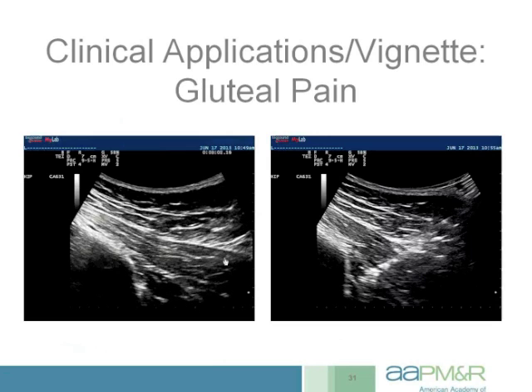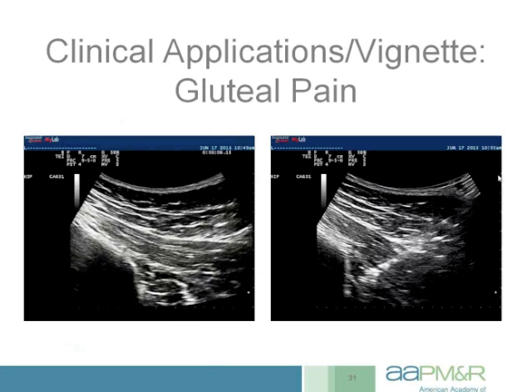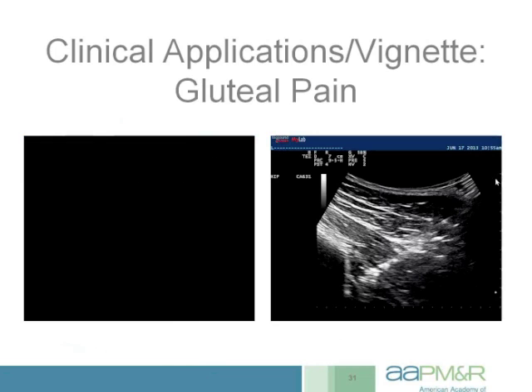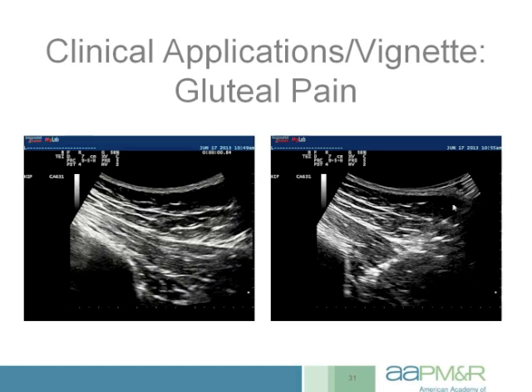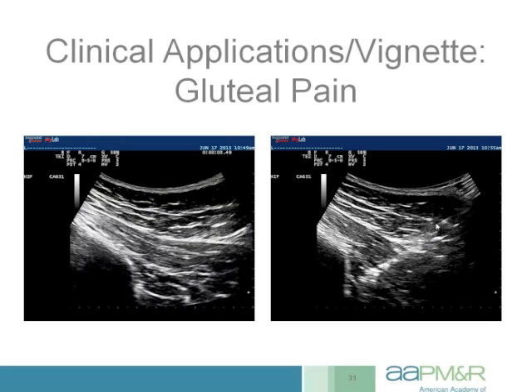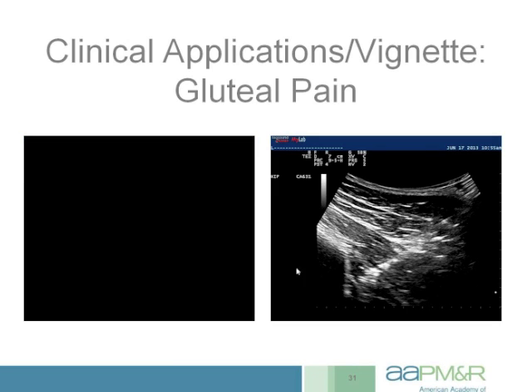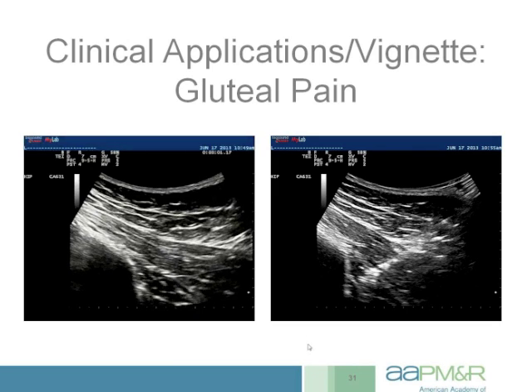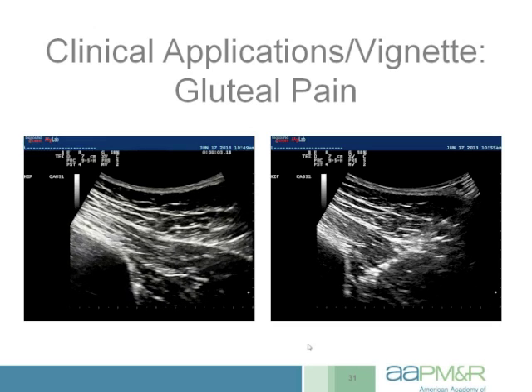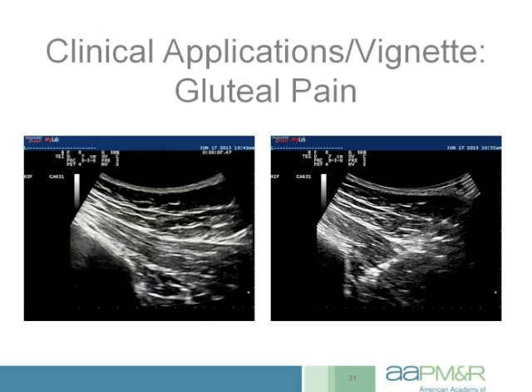Show that to you again here, and then this is a picture over here of the procedure itself. So here we brought in a needle lateral to medial, entering lateral to the probe, walking in below the ultrasound probe lateral to medial, going through the skin, subcutaneous tissues, glute max, and then landing the needle tip right here in the piriformis muscle. She had a very nice 100% anesthetic response after a low volume injection under guidance.